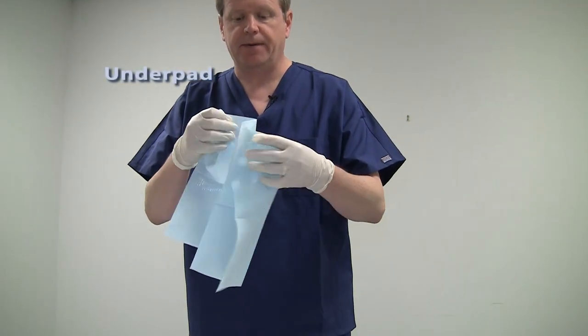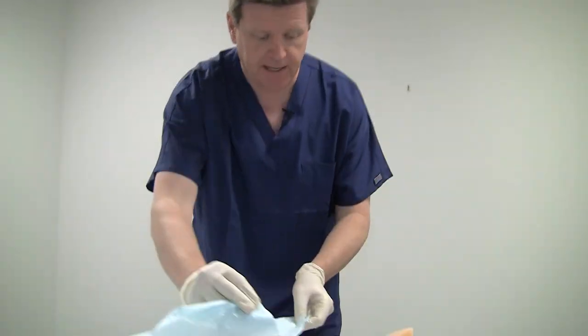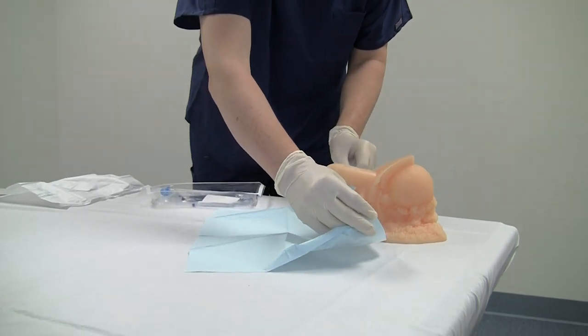After donning gloves, the next kit component we'll find is the underpad. And you want to place the underpad shiny side down, paper side up, on the patient's legs with the anatomy above in the middle, just like so.